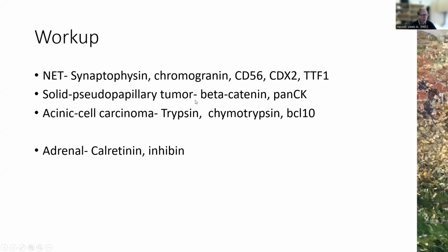Solid pseudopapillary tumor, we did do beta-catenin, pan-CK as well, and then chose the most available of the acinar cell carcinoma markers, trypsin, as well as including potentially calretinin and inhibin on the off chance that this is an adrenal medullary or a cortical type lesion.